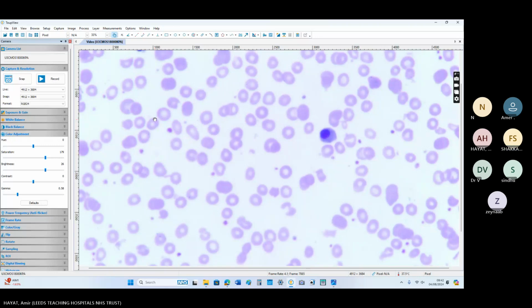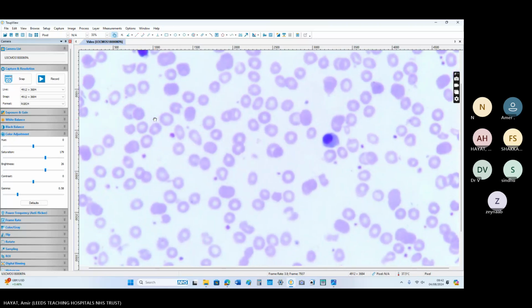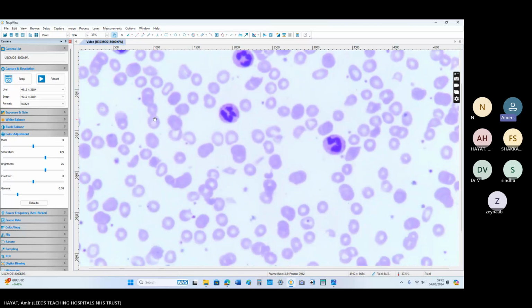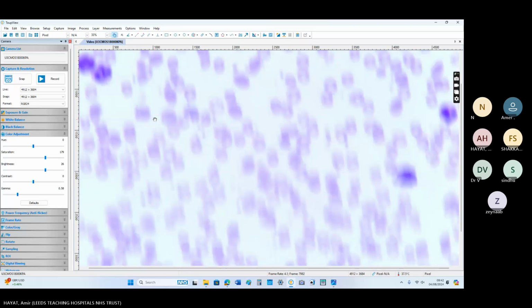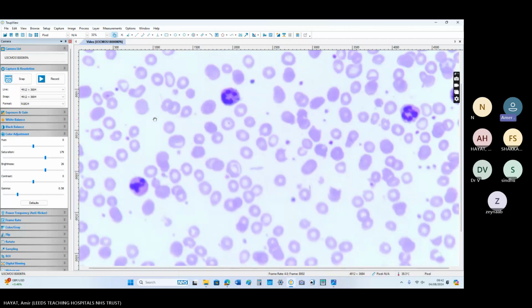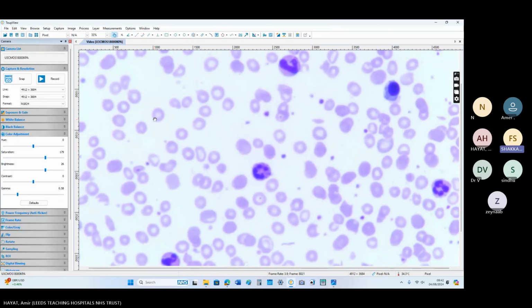Platelet count is normal though, or looks adequate on this blood film. Right. Is there any information in the history that is helping you or not? The blood pressure of the patient was 210 and 130. Oh yes, hypertensive.